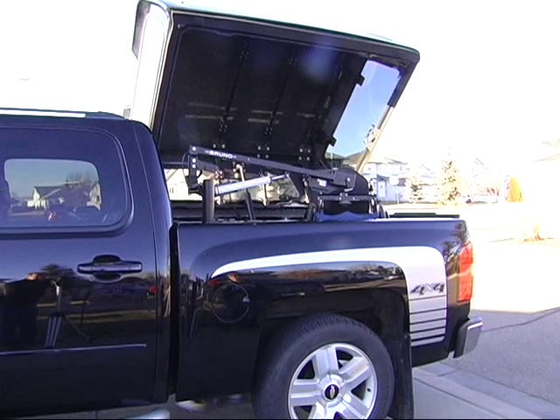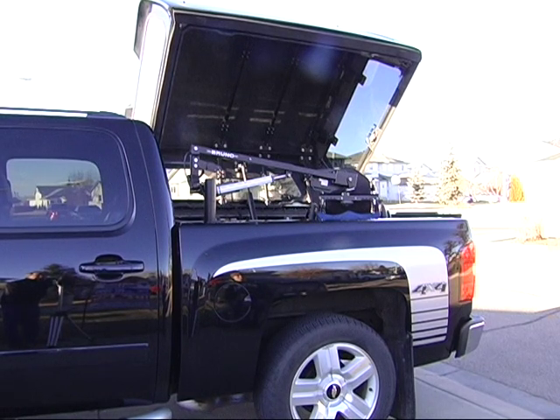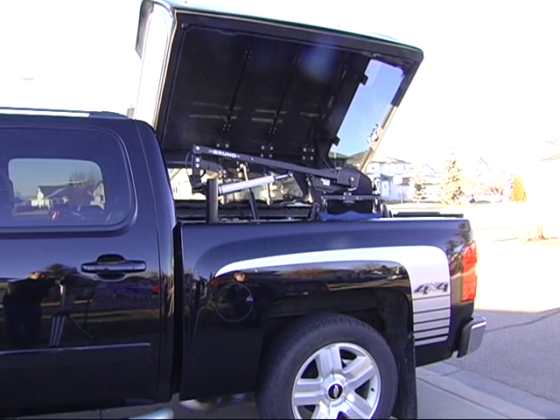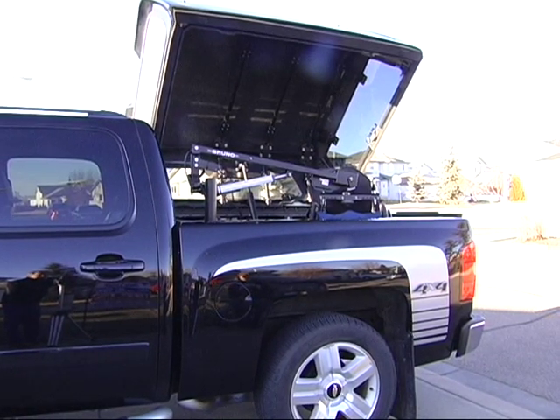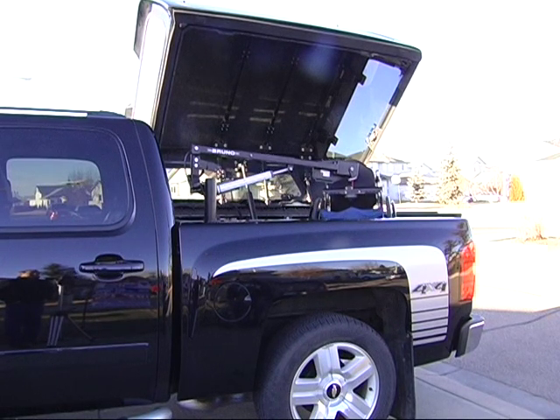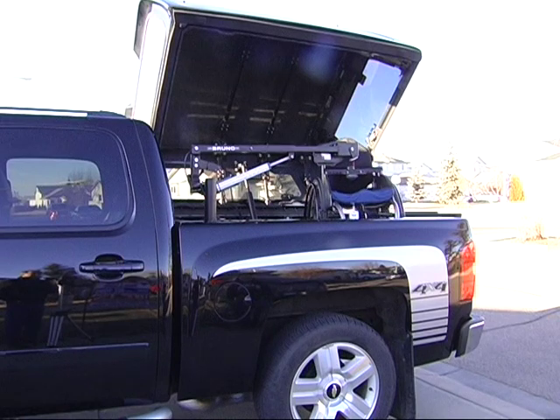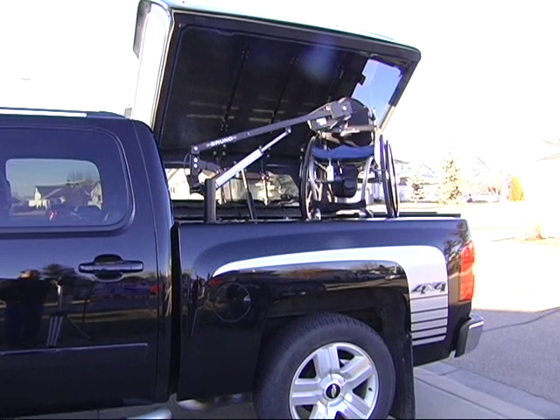And then once the canopy is all the way up, it's got limit switches, so the canopy or the chair do not exceed their limits. After that, the chair just gets pulled up by a Bruno arm, and it too has a limit switch, so it stops. So you just keep holding it until it stops itself.